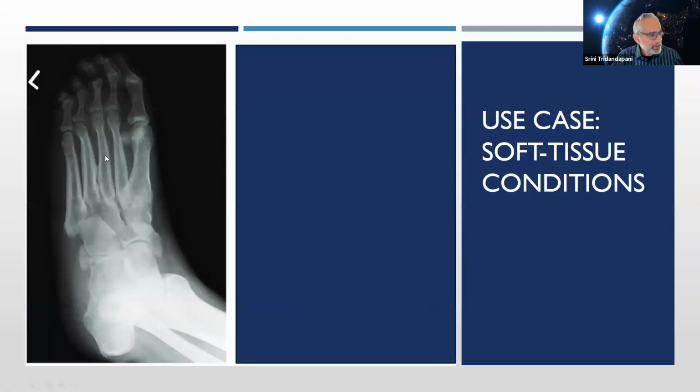So here was a foot radiograph that my musculoskeletal radiologist friend saw, and it had no information. We didn't know if they were looking for a fracture. We didn't know if they were looking for bone infection related to a diabetic foot ulcer, or if they were just looking for some other chronic finding like some arthritis.